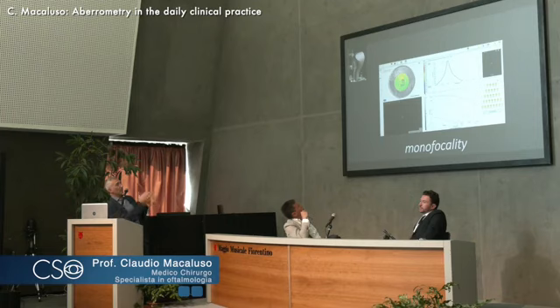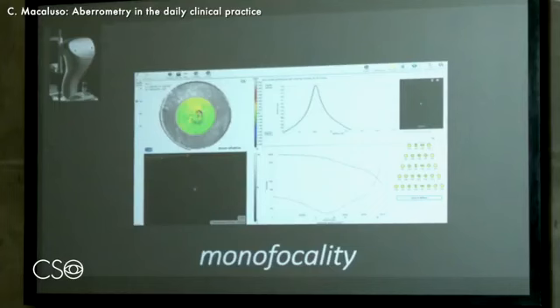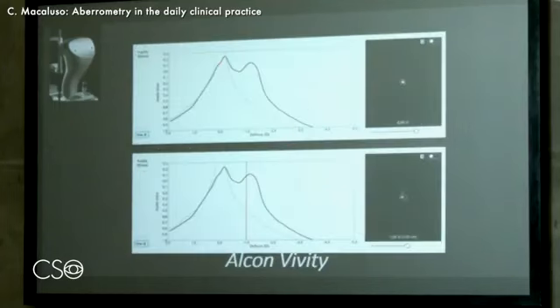It goes down sharply on the right where the myopic steps are. It's -1, -2, -3, and so forth. But already at -1, the acuity is very bad. In this case, here was the monofocality coming down here. Here, the focus and the visual acuity that you find is a simulation, of course, of visual acuity and estimation. The visual acuity is here.